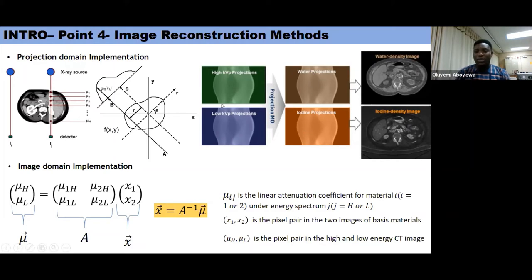The sinogram is just looking at your data at each projection versus the angle, because the tube rotates around the patient. So you are taking snapshots, the projection image, at different angles. As it rotates through the patient, you get a data set for that particular angle. Then they decompose that via Radon transform, and that is what is plotted as a sinogram. It is from this sinogram that our image is actually reconstructed, because encoded in this will be some frequency information that, when you do a Fourier transform, can be represented in a spatial domain like the normal image that we see.